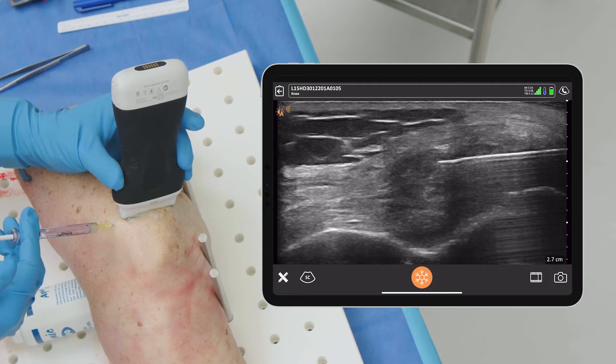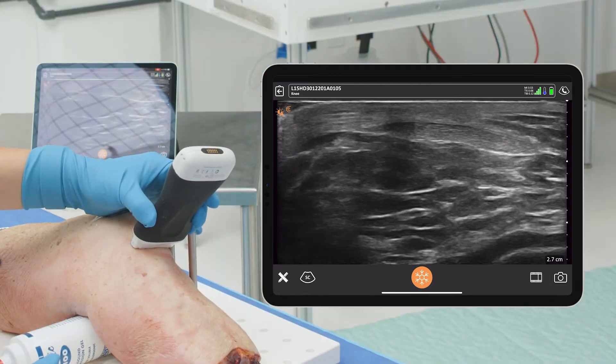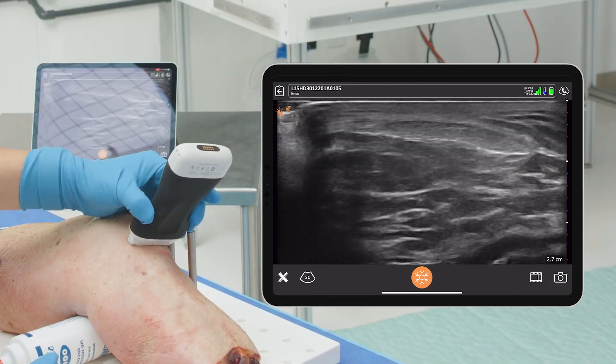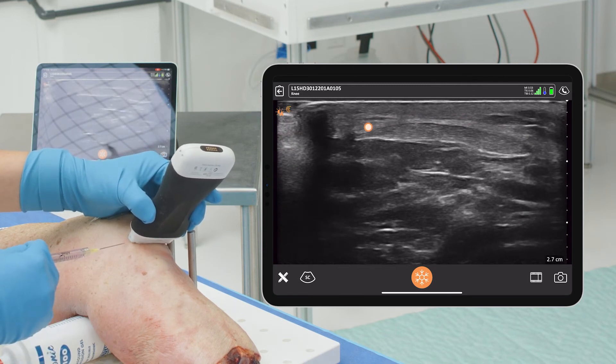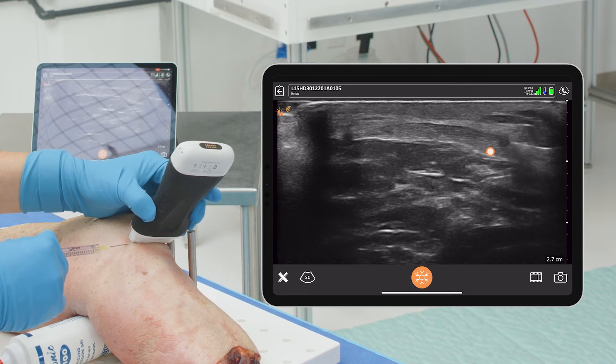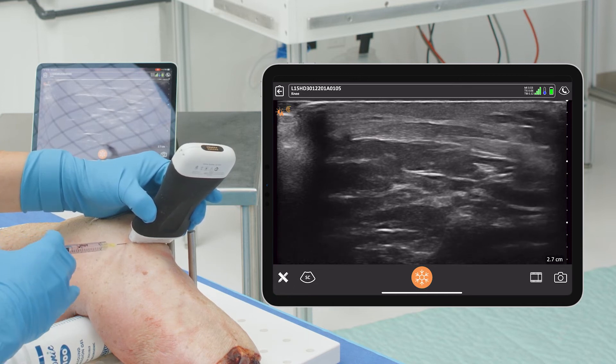This is the quad tendon. We could, of course, change this over and go to the patellar tendon — same concept. You can see that patellar tendon; that actually looks really good. Same concept: in-plane, come in, see your needle, get into the tendon where you want to be, and then give your injection.